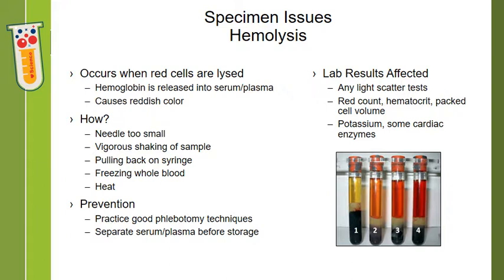Hemolysis can be prevented with good phlebotomy techniques. Make sure you separate your serum or plasma before freezing, and keep those tubes away from any heat sources in the lab. Hemolysis does affect certain lab results, and sometimes it depends on which test methodology you're using. Any lab test that is a light scatter or absorbance test is going to be affected by hemolysis. Hematology tests that might be affected include your red count, hematocrit, and packed cell volume. The chemistries affected include potassium, as well as some of your cardiac enzymes, like your CK.